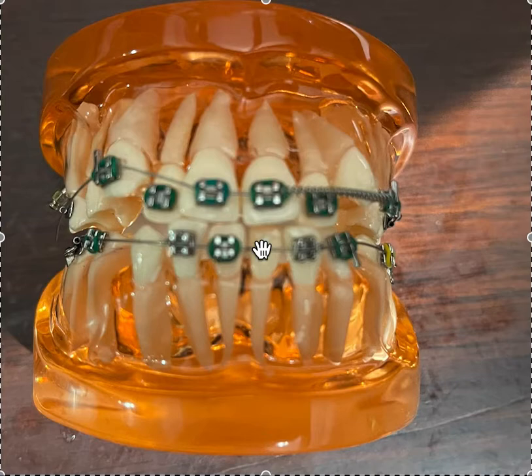So in a nutshell, again, I recommend general dentists use 022 because it's technique easier. You most likely aren't going to be using the heavier wires anyway and filling the slot 100%. The only time I do that is when I need max torque, or if I'm trying to get some expansion on an arch and put in a steel wire, then I'm going to max out the slot. So it's really not going to make any difference. I think it's going to be easier for you to manipulate, easier for you to use, and easier for you to train people using the 022 slot. Hopefully that was helpful. Thanks.